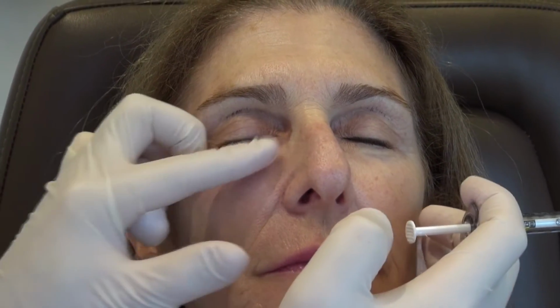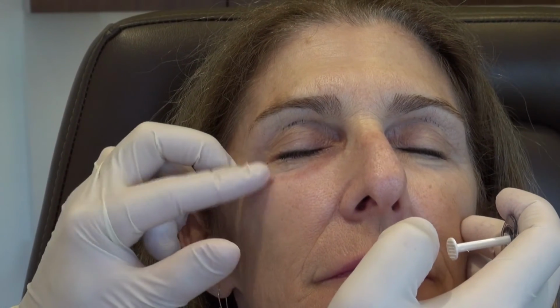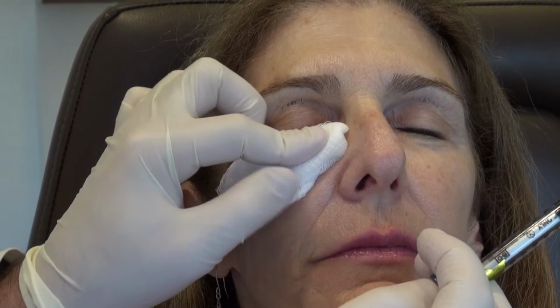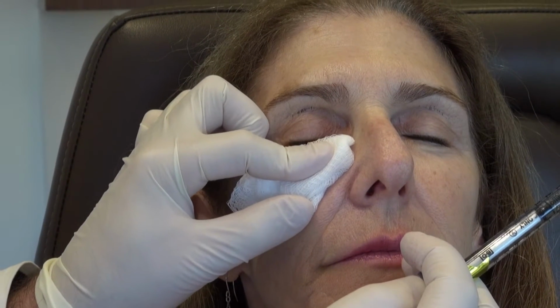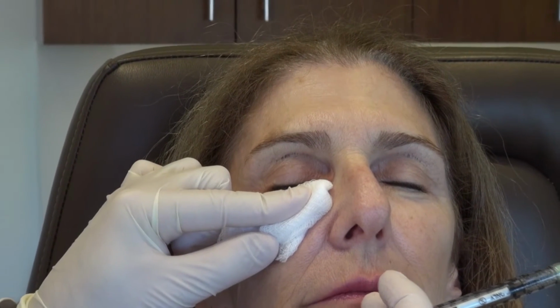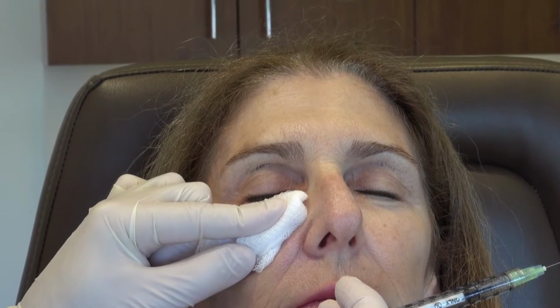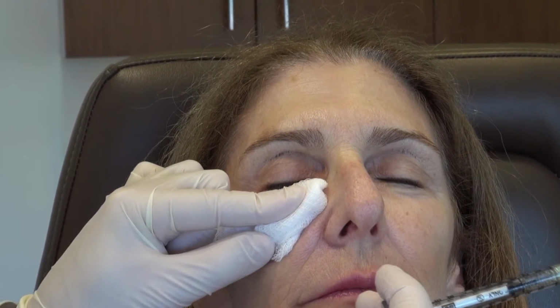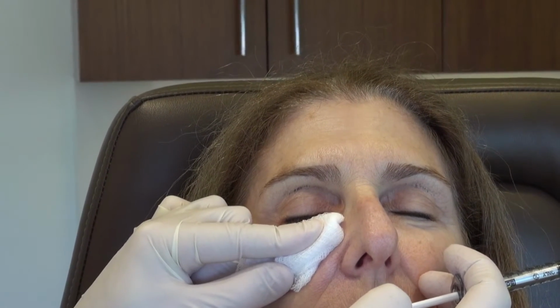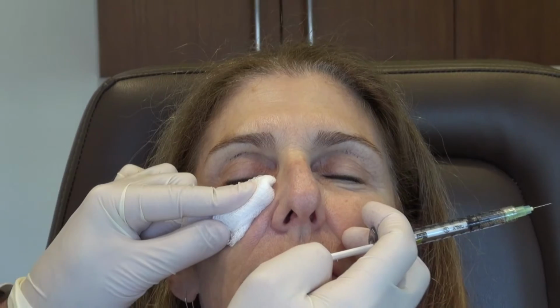So universal injection precautions: always keep the needle moving when you're injecting. Always use the smallest gauge needle possible. In this case, I'm using a 32 gauge needle, and I find that to be quite comfortable injecting a dilute product such as this. The other component is don't put a lot of pressure when you're injecting, so that even if you're in the wrong place, at least you're not putting a whole bunch of product into that place, and you're not putting it under extreme pressure, so that you're not overcoming systolic blood pressure, and you're not pushing product retrograde and up into vasculature, such as the ophthalmic vasculature, which you don't want.